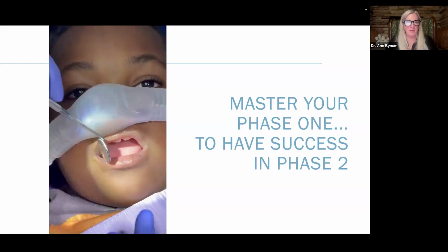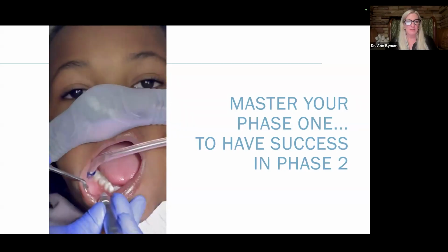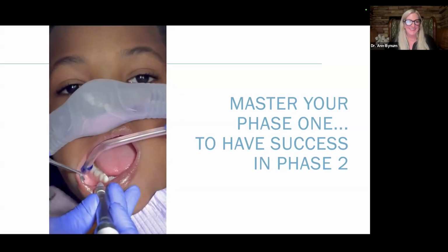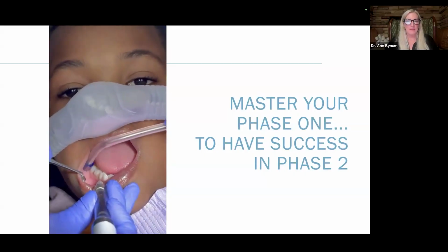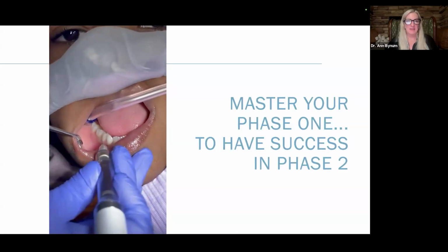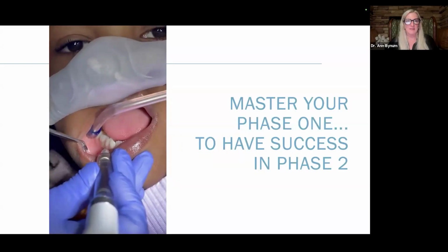This is a little video here of a kid who already looks drugged out, but they're not. So just showing how you're just leaning that needle in. And it's going to flex. You're going to see it flex. I love watching kids' eyes, right? They tell the story. This kid doesn't care.